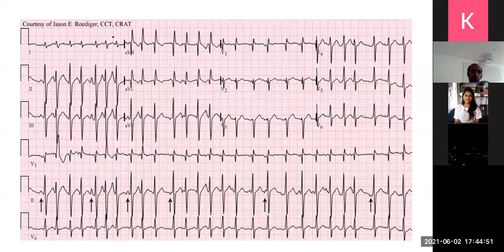Now look at this one. I've ignored the previous slide. I just want to show you this one. Now I just want you to look at lead 2, because actually assessing the rhythm is easiest in lead 2. Now you can see the QRS looks normal. Looks okay. But can you see the ones with arrows, children? Various abnormal looking P waves. Some are tall, some are short, some are inverted.